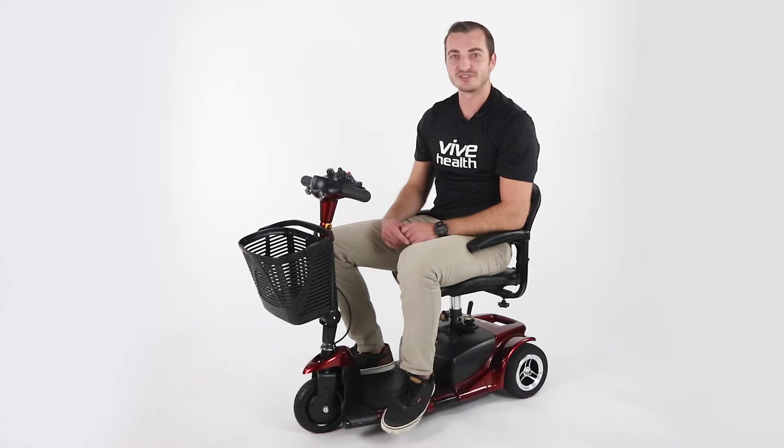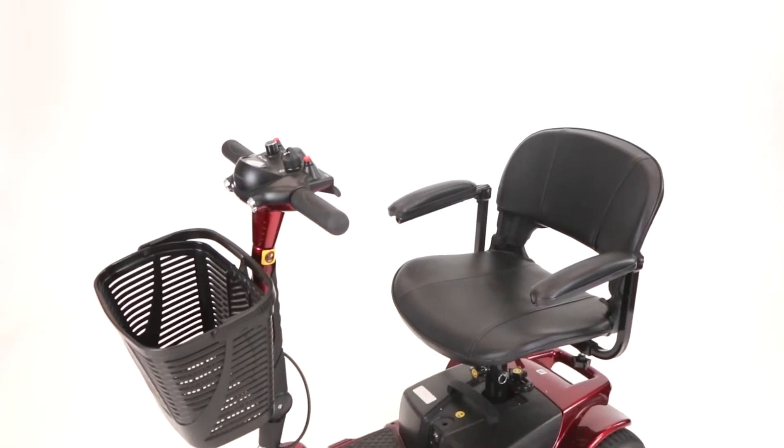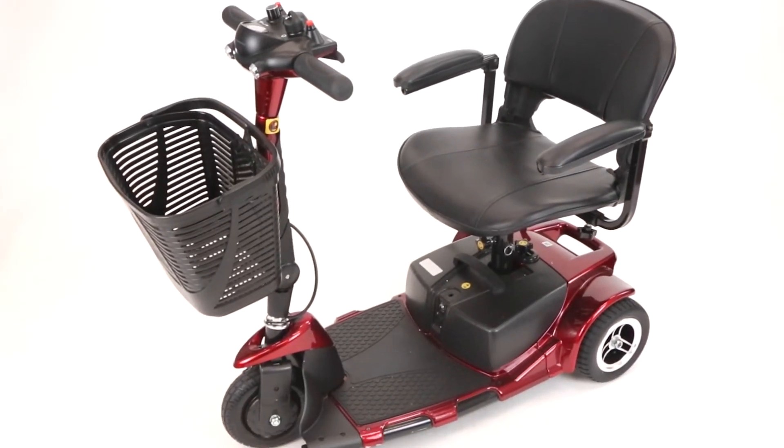Hi everyone, my name is Cory and I'm a sales rep here at Vive Health. Today I'm going to be talking about our three-wheel mobility scooter, just one of the many power mobility options we offer here at Vive.